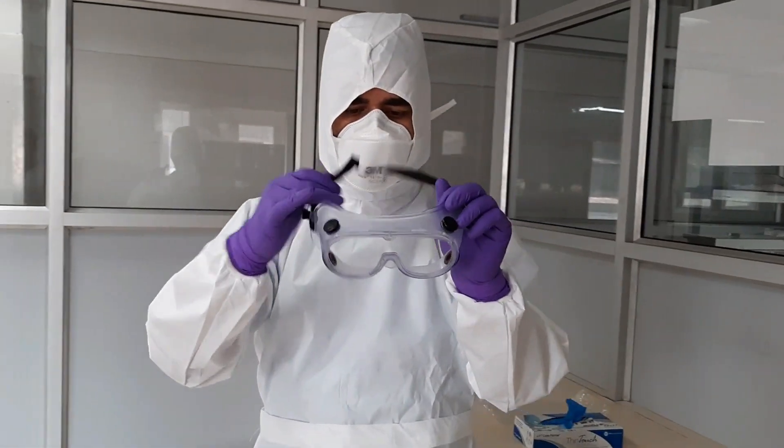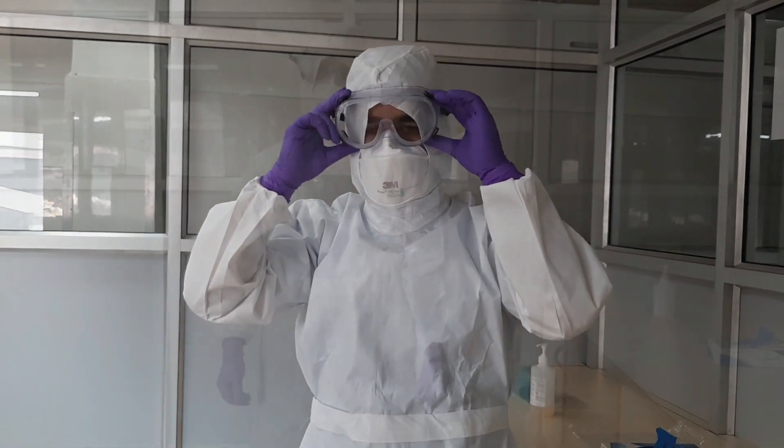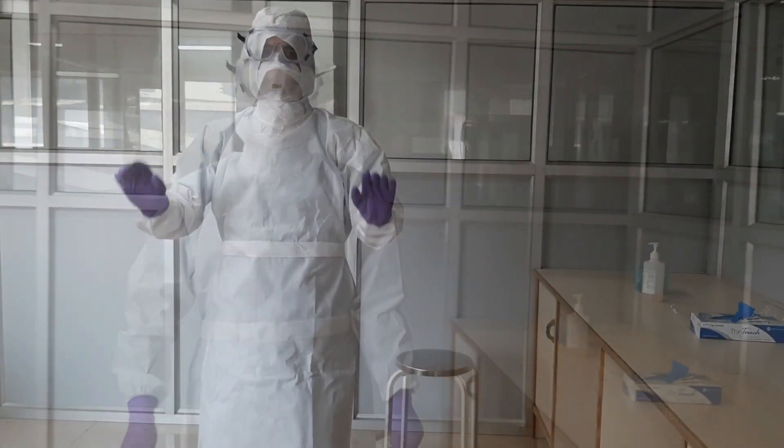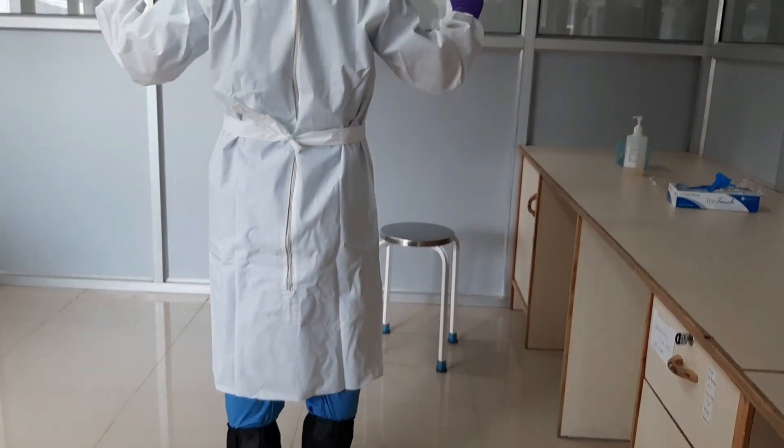Finally, wear protective eyeglasses or goggles provided in your PPE kit. You are now ready for sample collection or to provide necessary care in highly infectious zones.